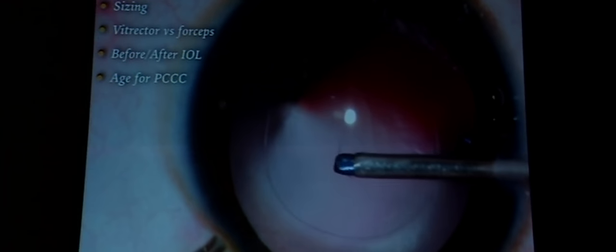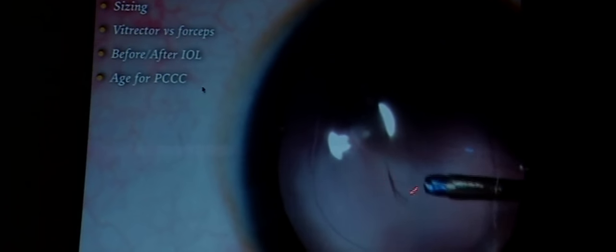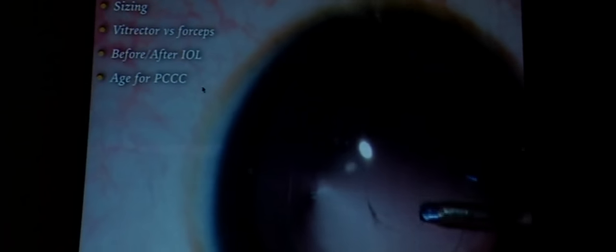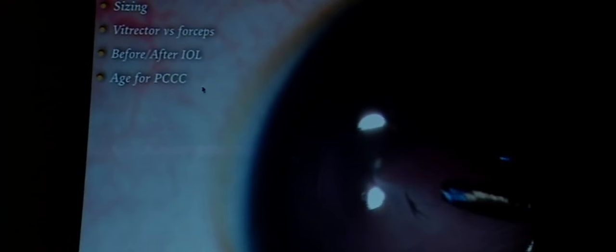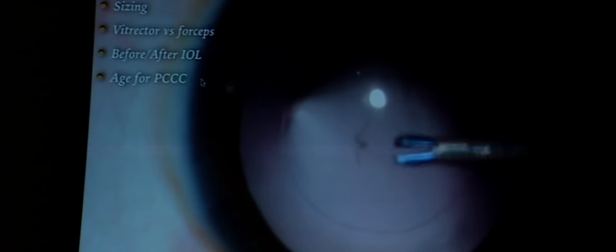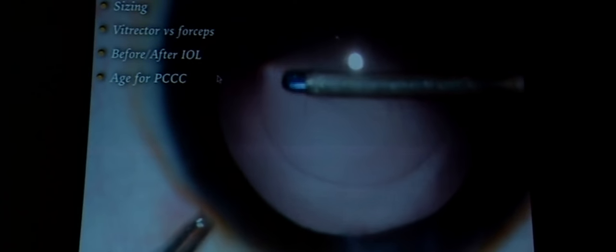I prefer to make a primary posterior capsulotomy: make a small nick in the posterior capsule with a needle, inject viscoelastic to push the anterior vitreous face back, then grasp the capsule with micro-rhexis forceps and using centripetal and anterior force, complete the posterior capsulotomy. This is actually easier than the anterior capsulotomy because it's smaller and the force is all directed centripetally — it is very rare to lose a posterior CCC.